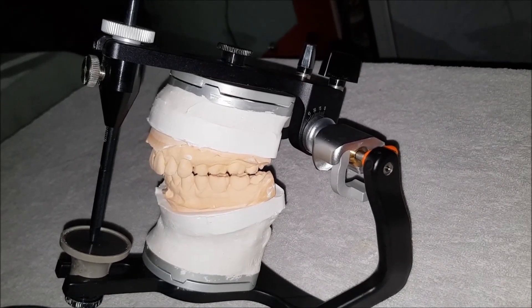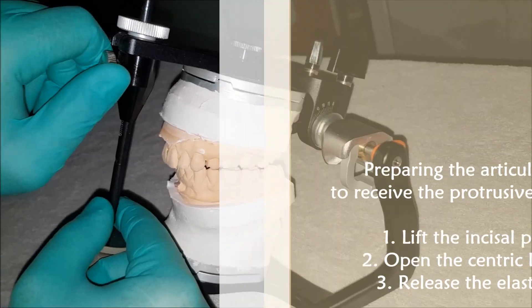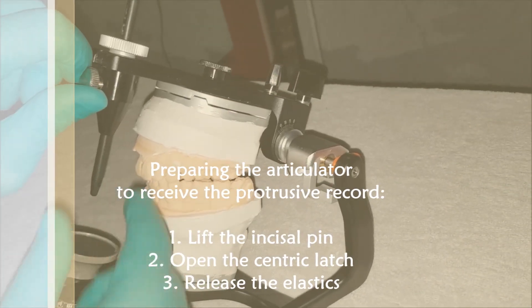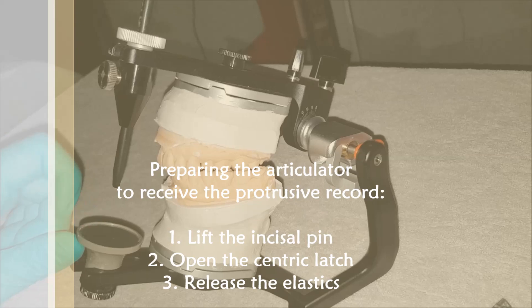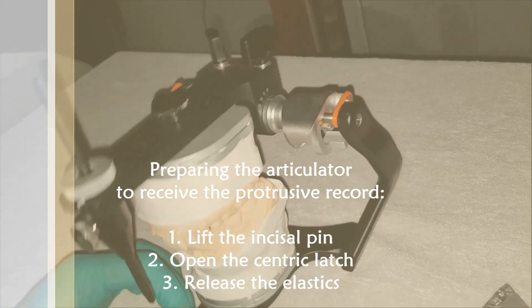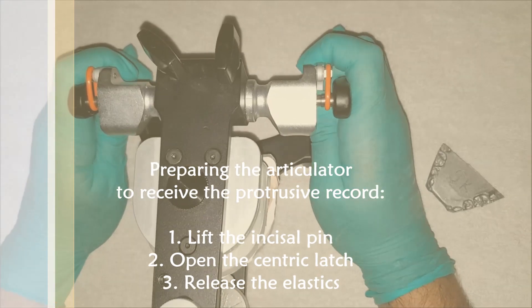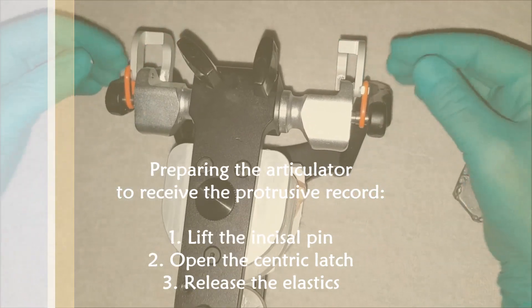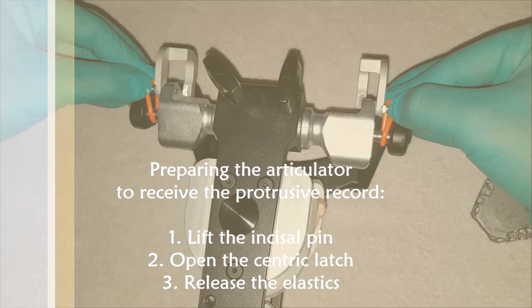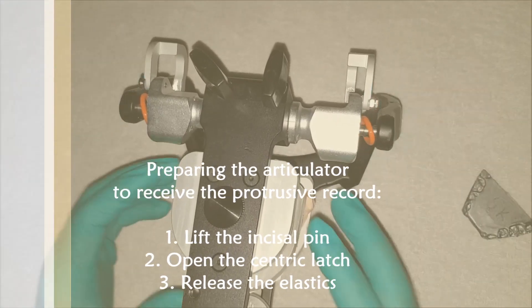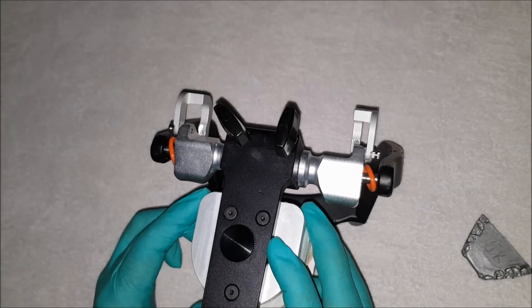For this, three things need to be done to prepare the articulator. First, we lift up the incisal pin so that it is no longer touching the incisal table. As I come on top of the articulator, here we open up what is called the centric latch. Once the centric latch is opened, the elastics are also released. This allows for the entire upper frame to be moved the way we wish.